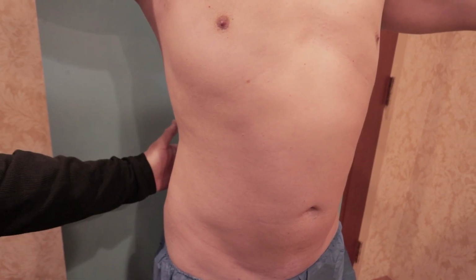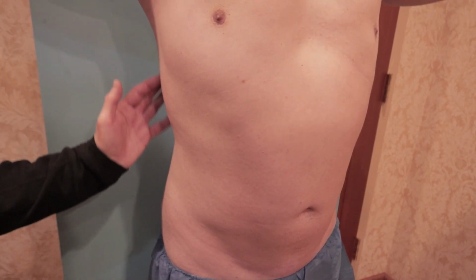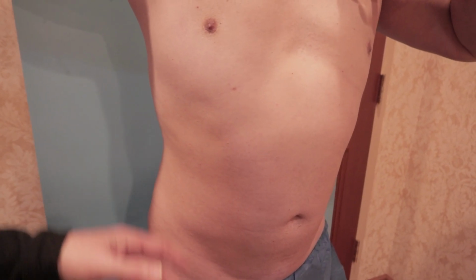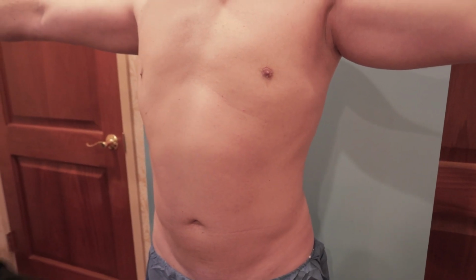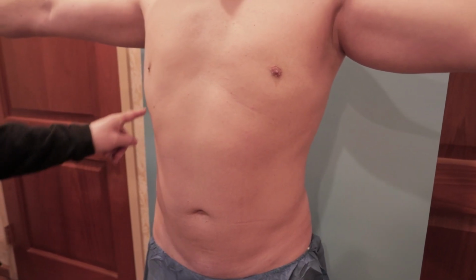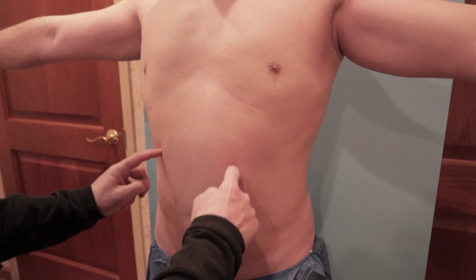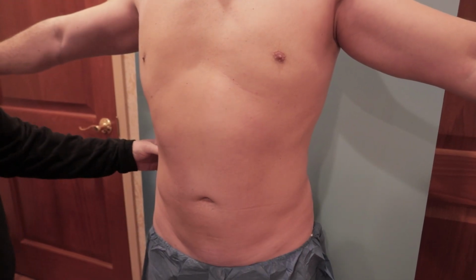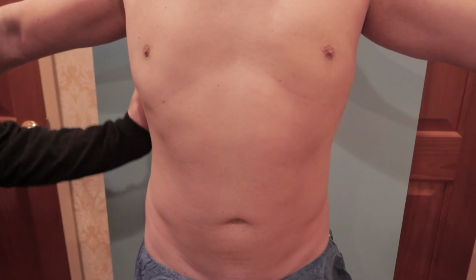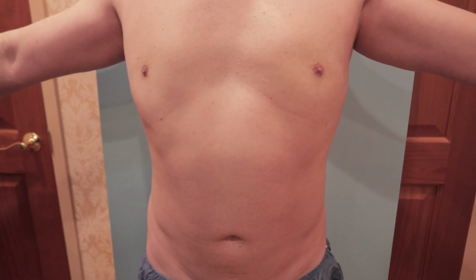He wants down here. We're not going to do the lower back, but he's awake. It's local anesthesia, so we'll turn him on his side, and we're going to scoot all the way down here. Stealth incisions, armpit, nipples, belly button, and groin. Get the midline linea alba, the semilunaris down to the V to P. Get a little bit of that FUPA. Get the serratus muscles. Again, it's about muscles. Get the six-pack abdomen, 2, 4, 6. Get the semilunaris, and really just scoop him down to accentuate his hip and his body, and just clean him up beautifully. And again, at the end, pectoral lipofilling.